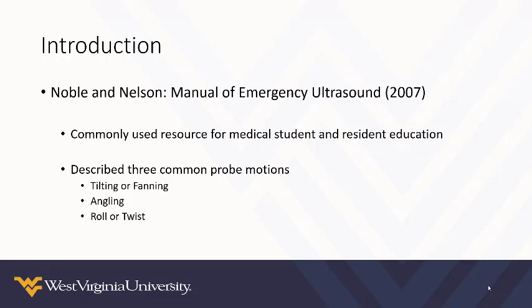In regards to point-of-care ultrasound specific to emergency medicine, many of our medical students and residents use the Manual of Emergency Ultrasound, which was published in 2007 by Drs. Noble and Nelson. In this text, they described 3 common probe motions as tilting or fanning, angling, and rolling/twisting.